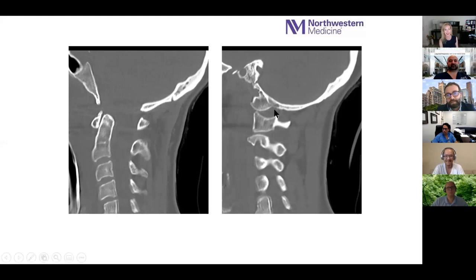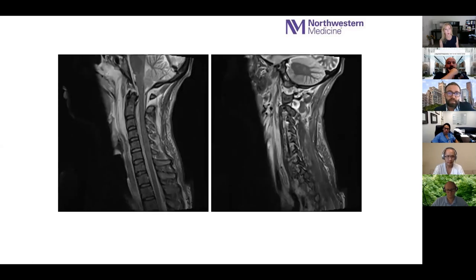So yeah, you've got dislocation there, or subluxation of C0 and C1. Exactly. So that's an AOD. Sometimes the basion-dental interval, if it's more than 12, that's AOD, but sometimes it's not. And if you look at this, they say, well, the scan does not explain the exam. Well, no, you've got to look at the parasagittals. This is important, because some of these patients present intact, and you don't want to miss this, and then mobilize these patients and miss an AOD, and then they sublux and they become paralyzed. And this is a STIR image here.